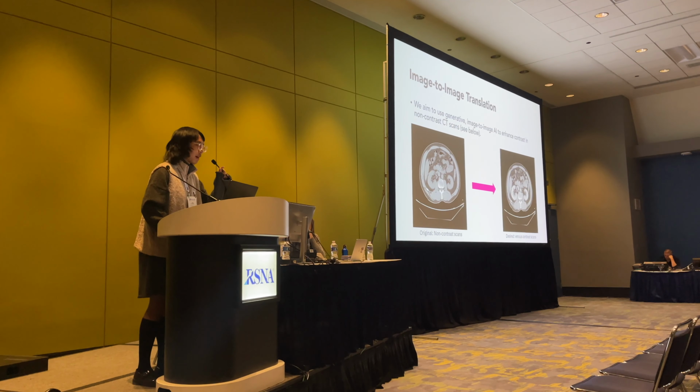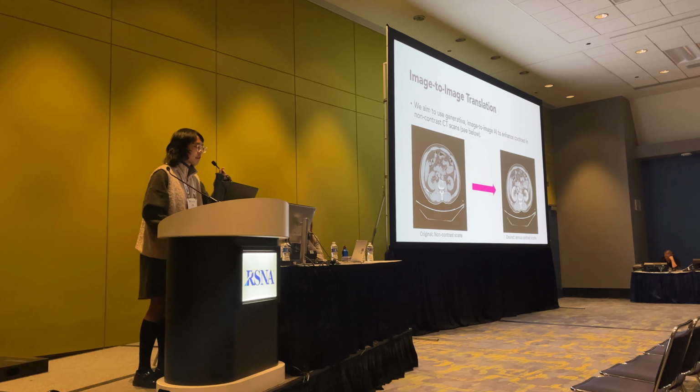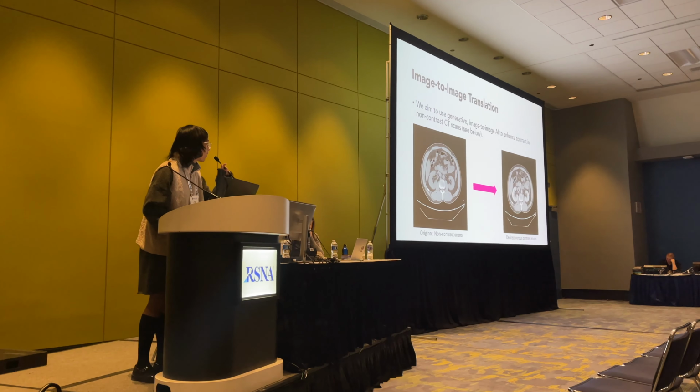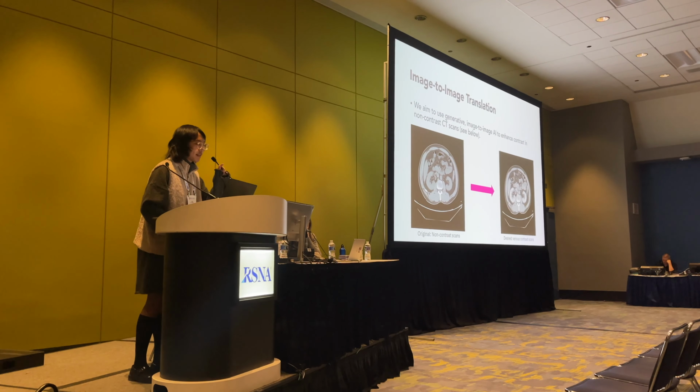Therefore, to address this problem, we aim to use generative image-to-image AI to enhance contrast in non-contrast scans. Here is an example of the task, where we want to enhance the original non-contrast scans to the desired venous contrast scans.